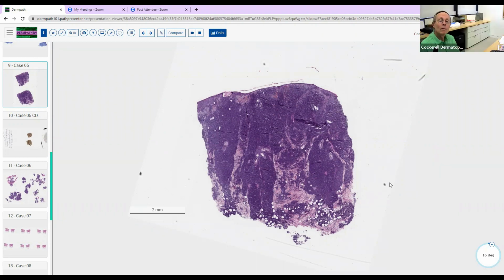Epithelial or non-epithelial? Non-epithelial. Yeah, and if non-epithelial, is it vascular? Is it fibrohistiocytic? Is it neural? Is it muscle? Or is it something else? I thought it was maybe bone marrow derived. Good, yes, absolutely. Lymphoid, somewhere in that category. Good. And do you think it's benign or malignant based on this pattern? I would say malignant. Yeah, you're right.